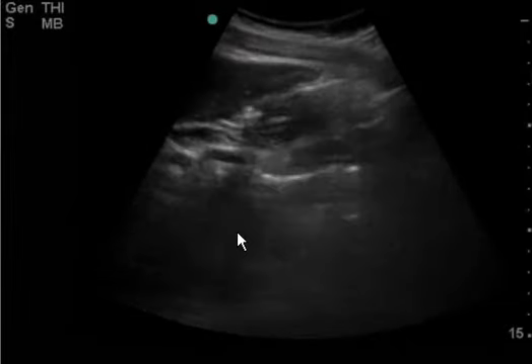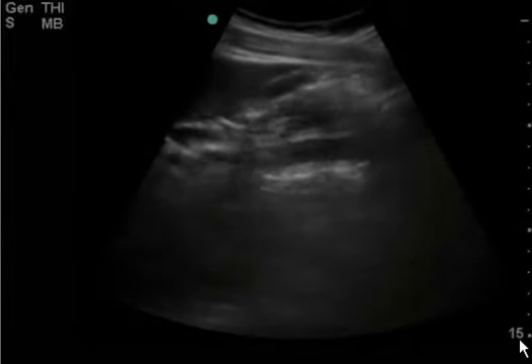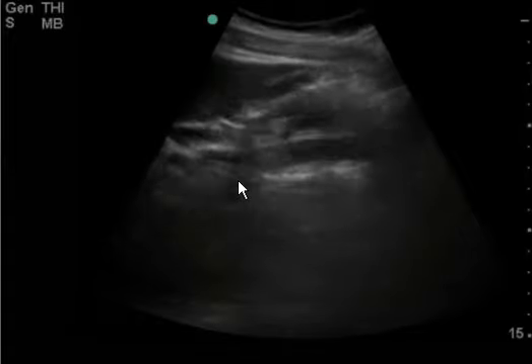Here's another view. You can see the aorta and there's the IVC, but again your gallbladder is the one in question. And again 15 centimeters deep — you can pretty much cut this in half and really be able to focus on the gallbladder and get better clips.